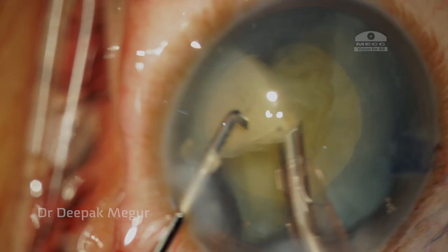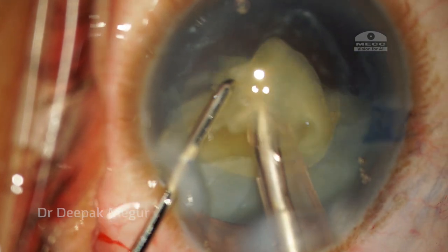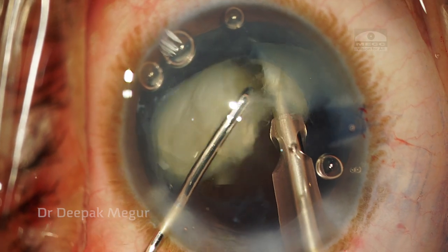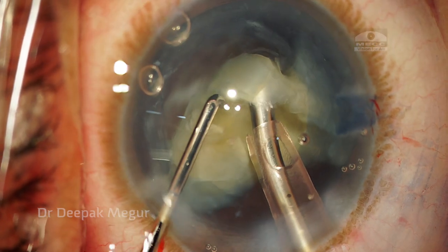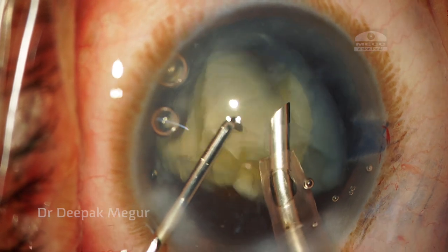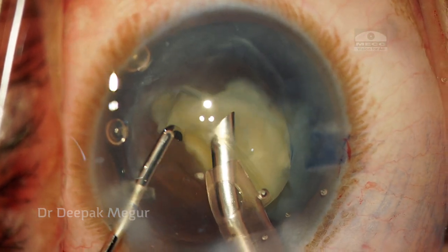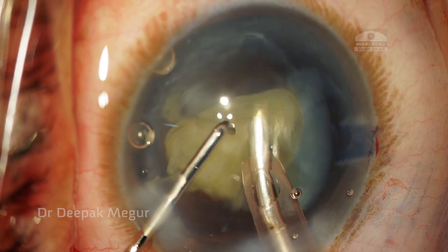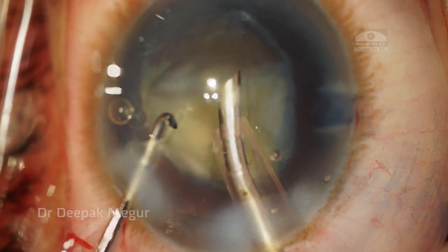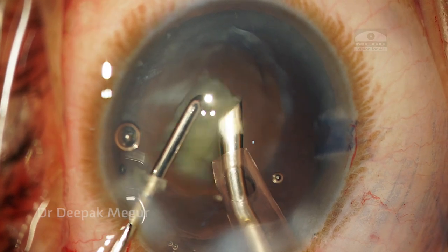This is an elderly lady who has a hypermature cataract. We begin the surgery — the capsulorhexis has already been performed and the nucleus is being chopped into small quadrants and emulsified. The second hemi-nucleus is being chopped. Care is taken that the emulsification is being done at a much more posterior plane at the level of the capsulorhexis. This ensures that the energy delivered is much more posterior, the turbulence and fragments hitting the corneal endothelium are minimized, and hence endothelial protection is maximized.